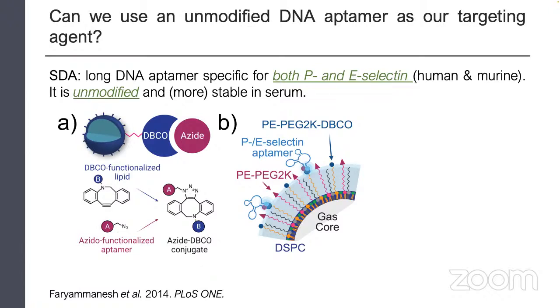So when we are talking about labeling our microbubbles, we're actually getting, in this case, about 140,000 individual aptamers onto the surface of each individual microbubble. So if you can think about it, that gives us a really high avidity. Even if over 5 minutes, which is a really short imaging time, we lost 20% of the aptamers on our surface, we'd still have over 100,000 aptamers on there. We'd still have enough to bind. And so what we think is if we just make a really inexpensive aptamer, we'll still be able to see it, but we'll be able to dramatically drop the price down.